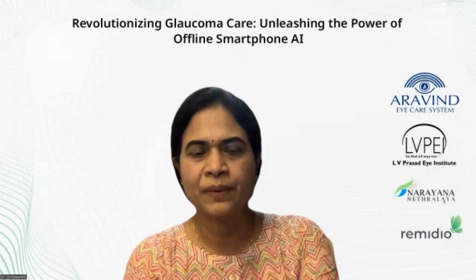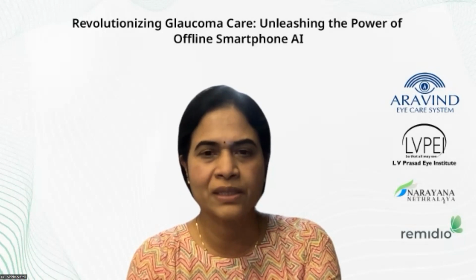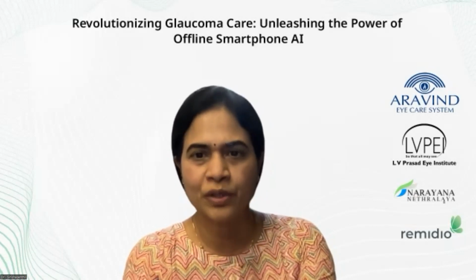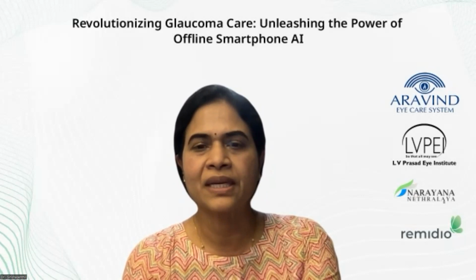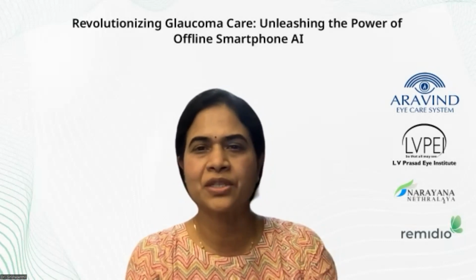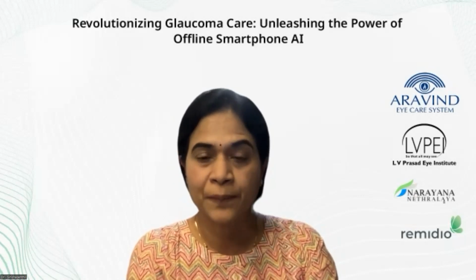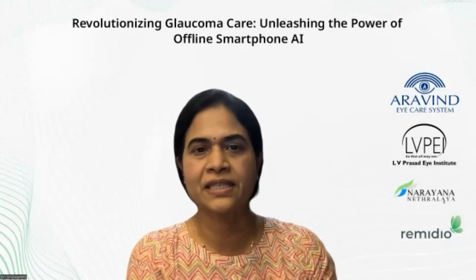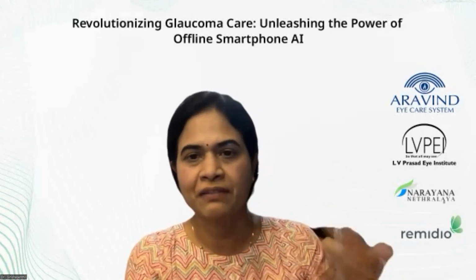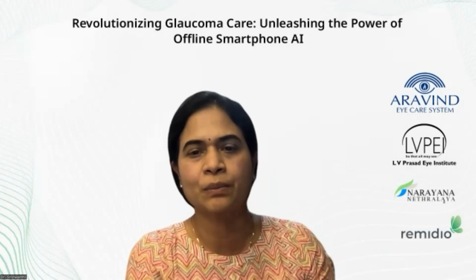So I would look at it this way. I'm not saying that the general ophthalmologists don't do a good job. I think glaucoma is a comprehensive ophthalmologist skill that each and every person who does ophthalmology should know, to pick up glaucoma. But the training level is very different, and it is not easy to pick up glaucoma, because if you look at those images, it's not easy. Even for a specialist, sometimes you may have to take a second look, and you may have to have a depth view of what subtle changes are happening in the optic disc. You have to have a better exposure. The patient is not allowing you to look because of the bright light. They just give you a few seconds to take a look at the posterior segment.